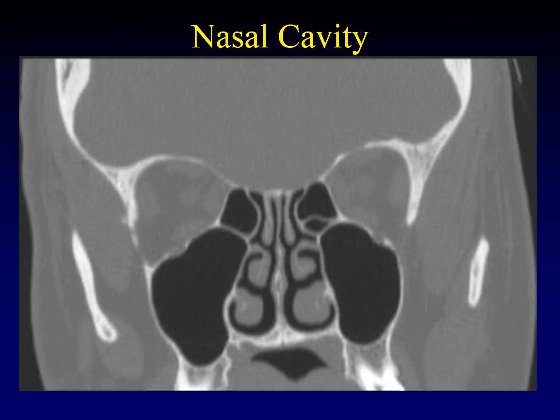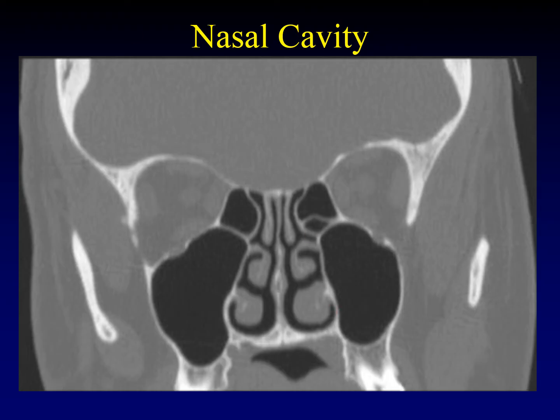Here's a coronal CT through the center of the nasal cavity. The nasal septum runs right down the center, dividing the nasal cavity in half. On each side, there are three turbinates filling the nasal cavity. Underneath each turbinate — lateral to the bulk of the turbinate — is a corresponding meatus. So we have superior, middle, and inferior turbinates, and deep to those we have superior, middle, and inferior meatuses. The floor of the nasal cavity is the hard palate, and the lateral walls are the medial walls of the maxillary sinuses. The roof of the nasal cavity is the anterior skull base.